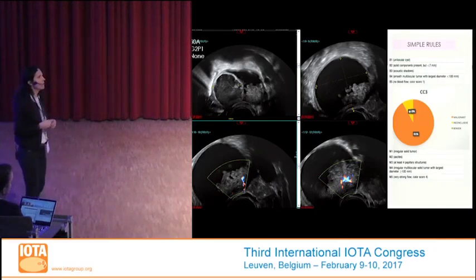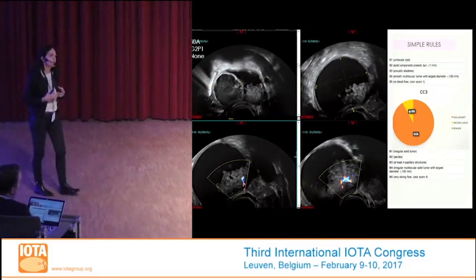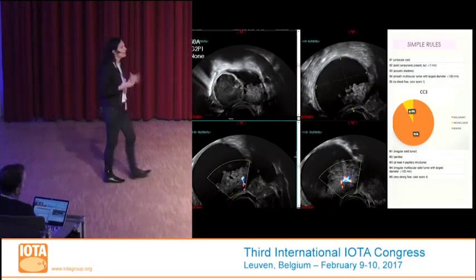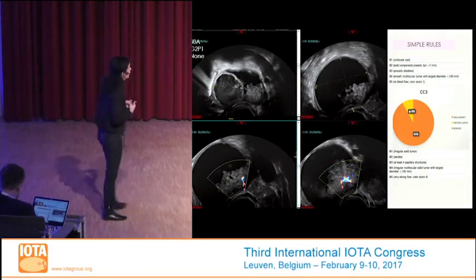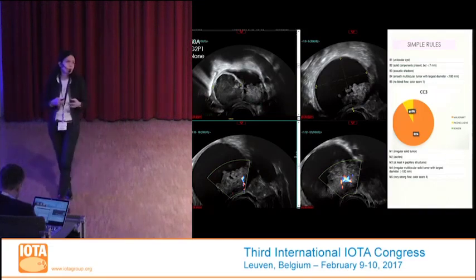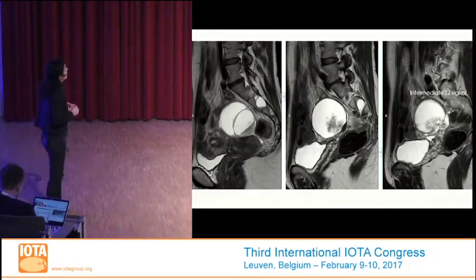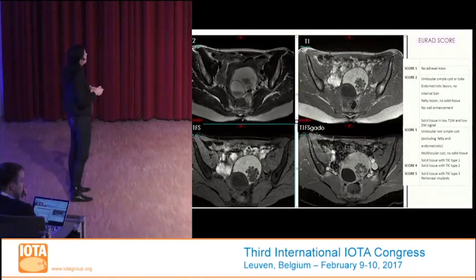But finally, what's the issue for this lesion? What's the real question? Malignant, yes, but the problem is to know if it's a borderline lesion or an invasive carcinoma. And using ultrasonography, as we saw this morning and yesterday, it's not always very easy to make the difference using ultrasonographic findings. Here the MRI, T2-weighted MRI. You recognize here the cyst with the solid tissue there. We are sure it's solid tissue because when we compare before and after gadolinium injection, there is an enhancement, so there is a solid tissue.